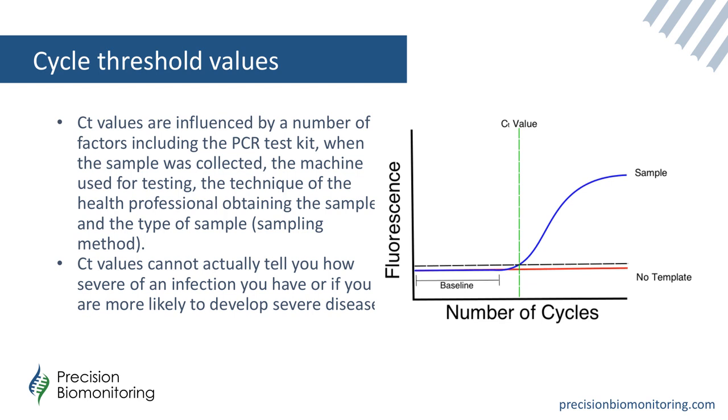So for example, when you test someone with a saliva collection at the same time as a nasopharyngeal swab collection, you may have a different CT value. The idea is that you have a range of CT values that are still going to give you an accurate representation of what a positive sample should look like for a specific sample type. So it is important to factor that in terms of ranges and cutoffs and interpreting the results that come out.